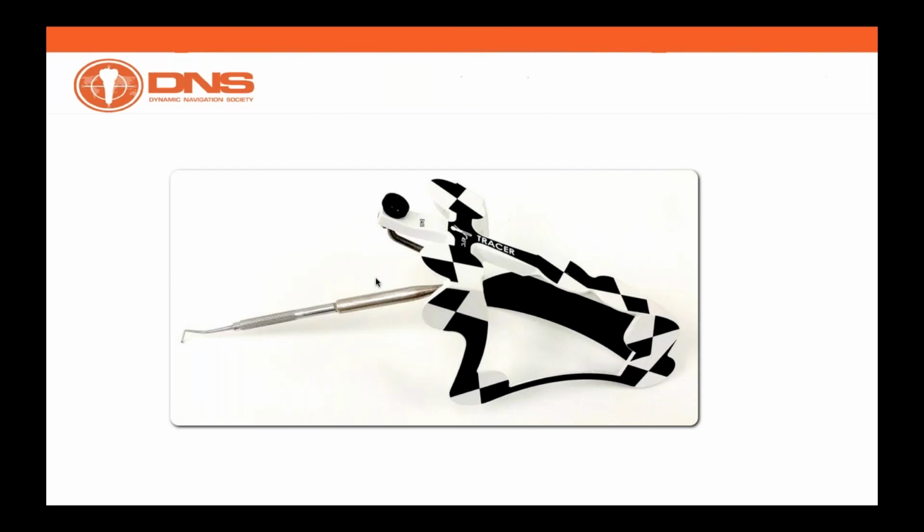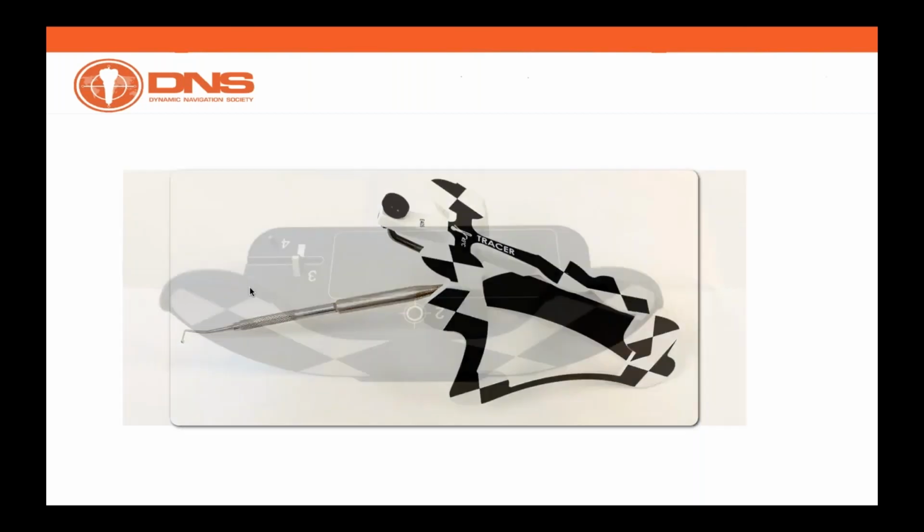So what we do first of all is use a tracer. This is a tracer, which is nothing more than a contact scanner, which has a probe. You see, there's a tool with a round-shaped probe, which we can use to contour surfaces. And as we said, we can contour crown surfaces, and get the matching and get the registration.